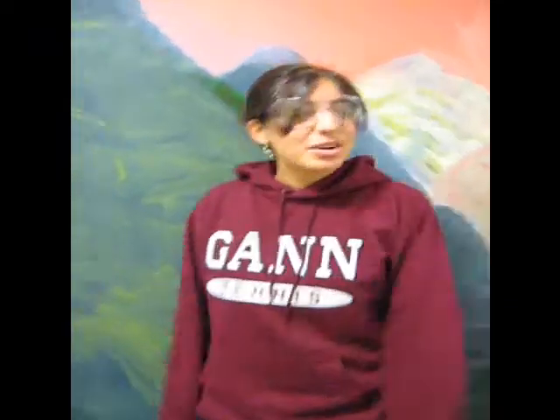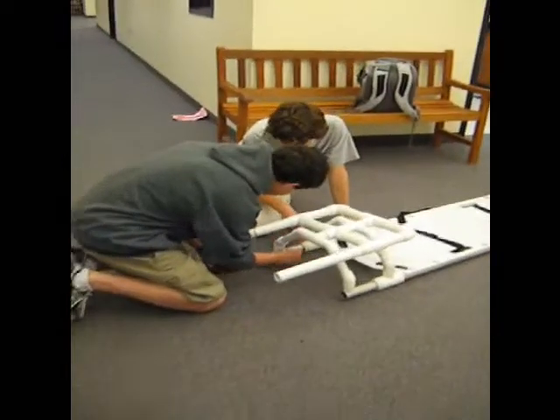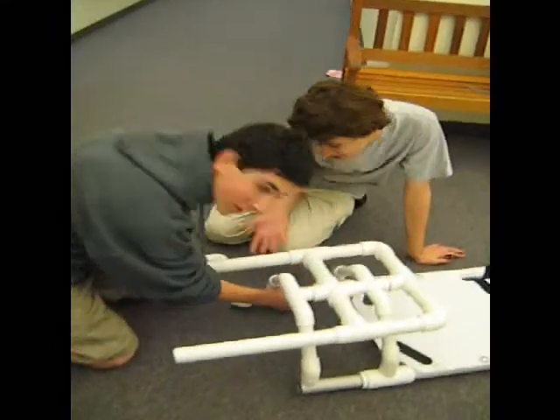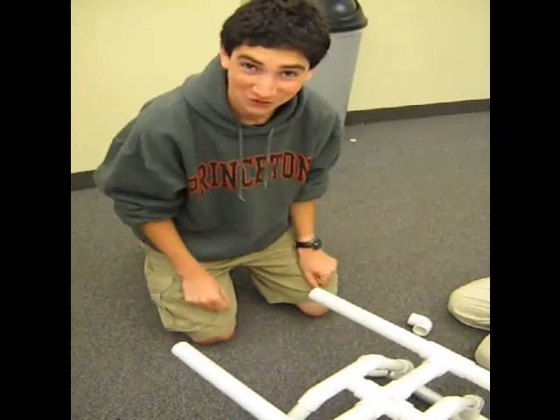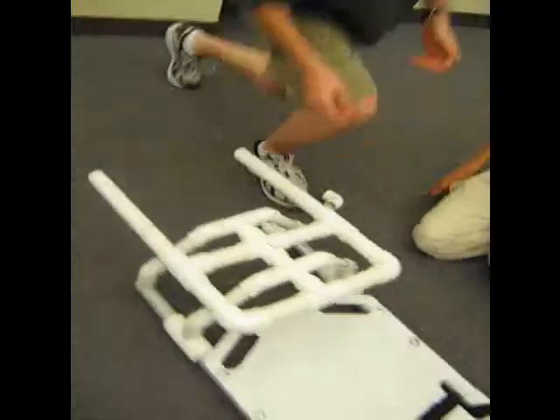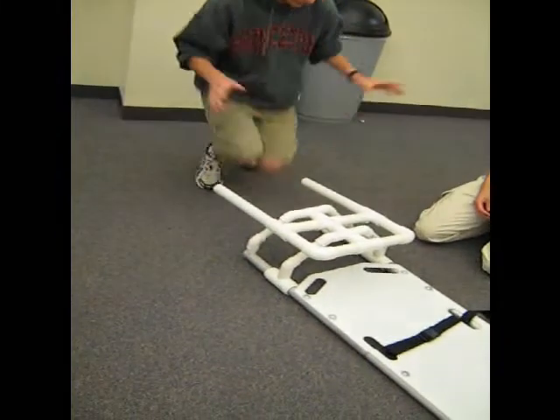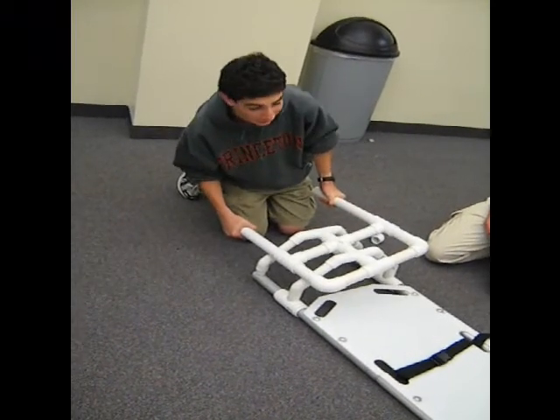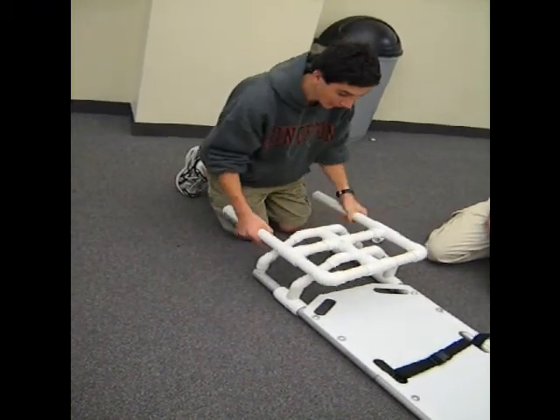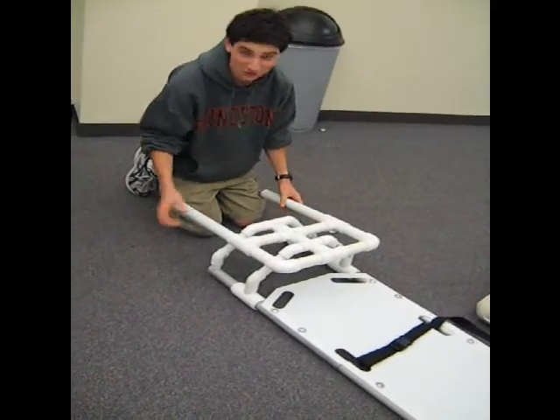Hi, I'm Invar. Welcome to Gann Academy. This is our new weight stabilizing compact and lightweight stretcher. As you can see, the patient lays on this portion of the stretcher, and the rescue personnel hold the stretcher by these handles. And if one of them tips to one side while walking, the patient, because they're hanging from this fulcrum, will hang perfectly horizontally and will not tip over.